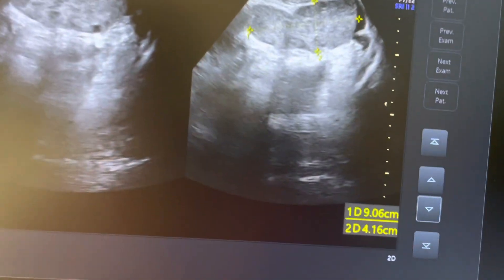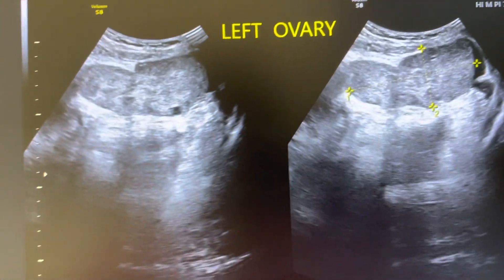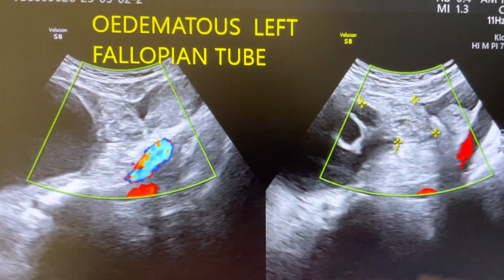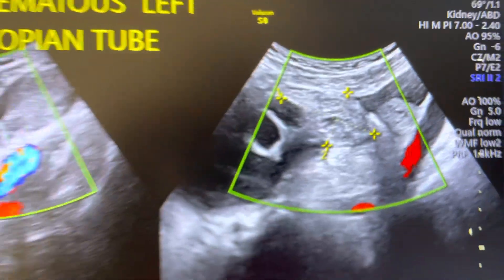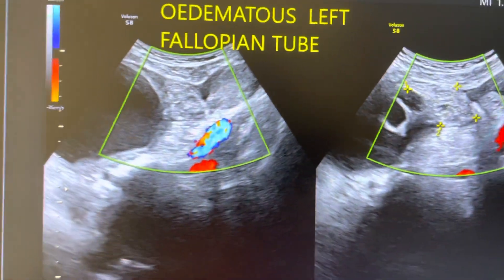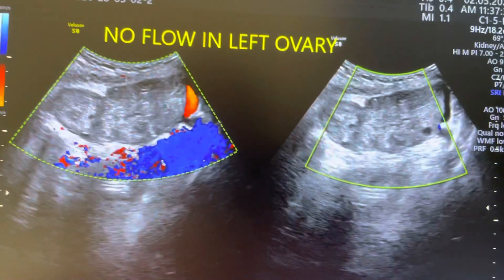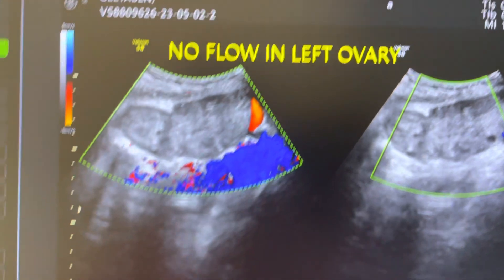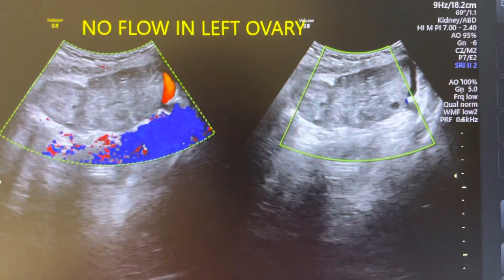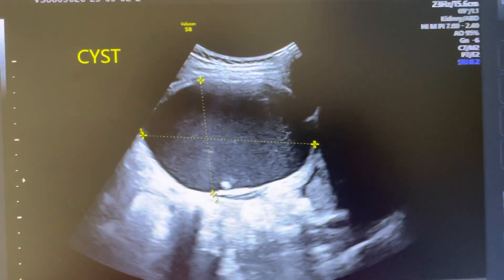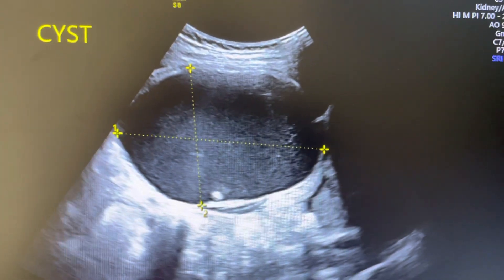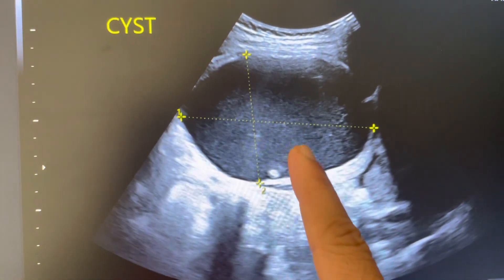There are multiple peripheral follicles. This area here is the fallopian tube — it was showing a whirlpool sign due to the torsion. There was also a cyst near the fallopian tube. Inside the ovary, there is no flow — we kept the velocity setting at 9 and still no vascularity is appreciated. There was a cyst inside this left ovary with internal echoes.